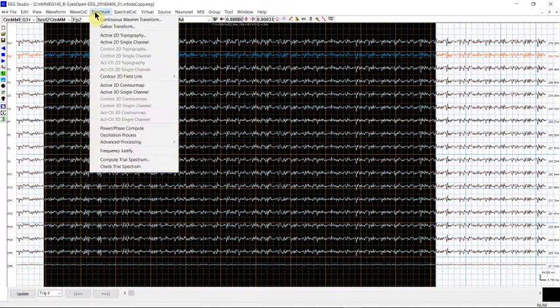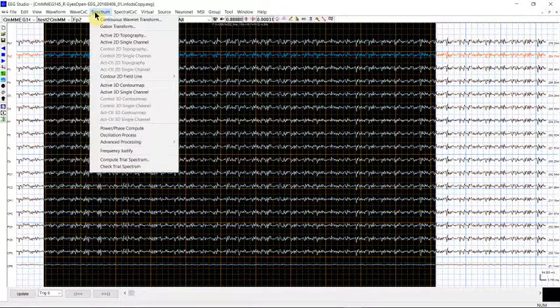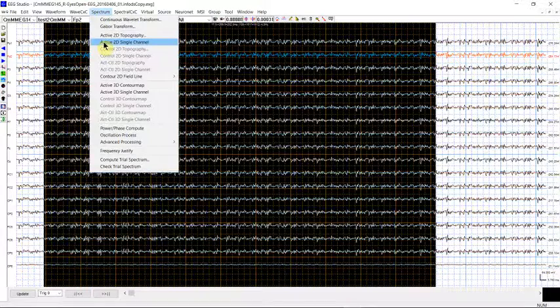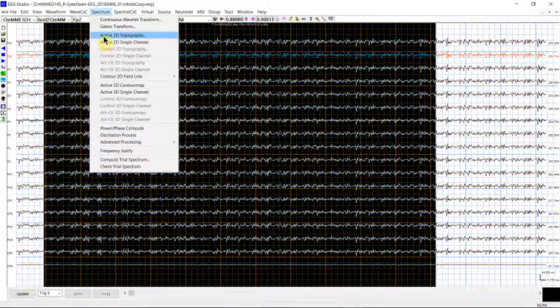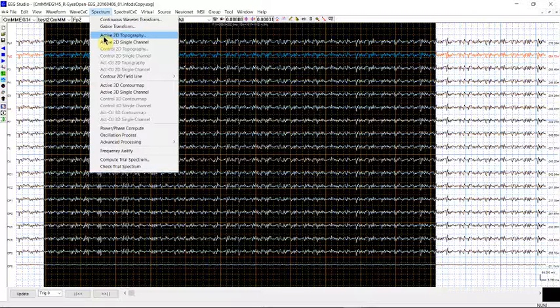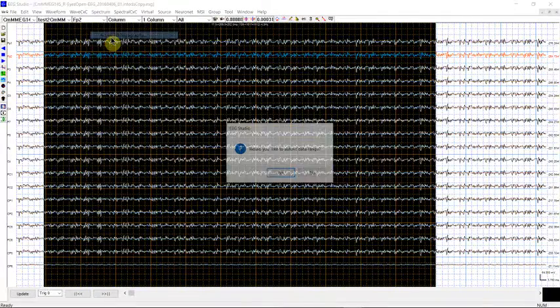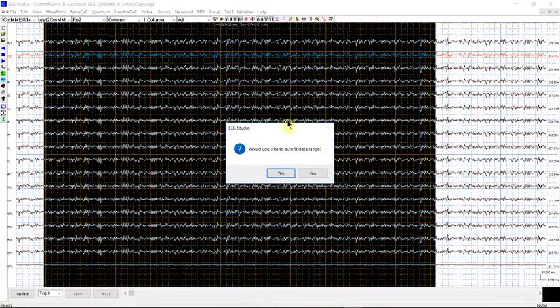In our previous tutorial, we looked at the single channel spectral data. Now, if you want to know the spatial distribution or the topographic information, we can use the topographic here.